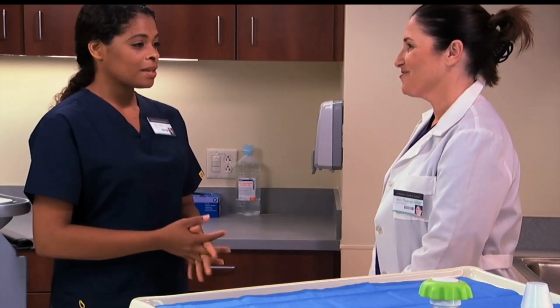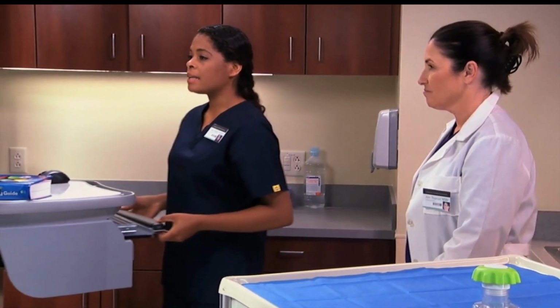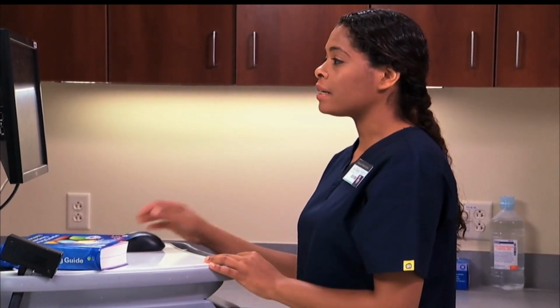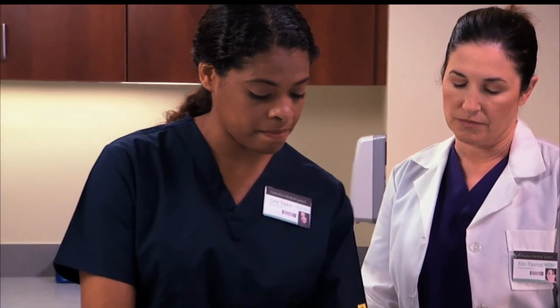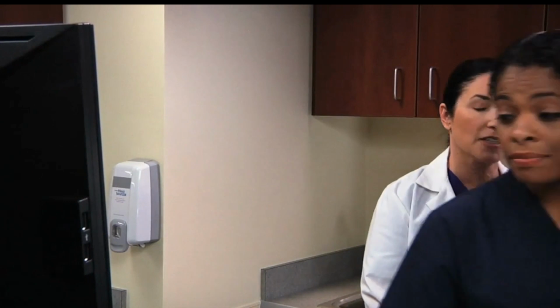So what's first? Okay, so I enter the passcode into the computer and select the proper patient. Then I read the medication administration record, the MAR, and select the correct medication from the patient's drawer, which is the first check. Guaifenesin, 400 milligrams, seems appropriate to help with the patient's cough. Correct. That's check 1. Next, compare the label with the MAR, which is the second check. Check expiration dates and perform any calculations necessary.